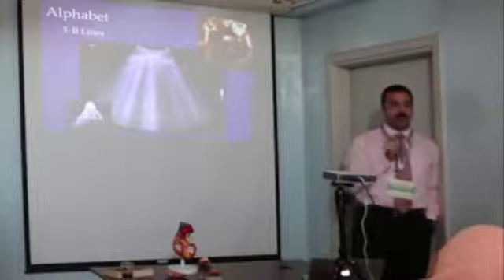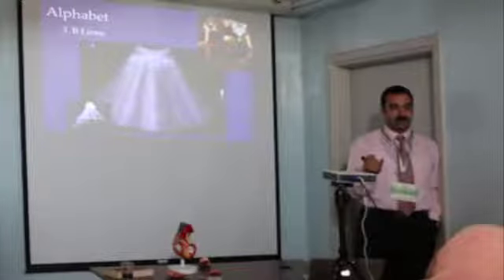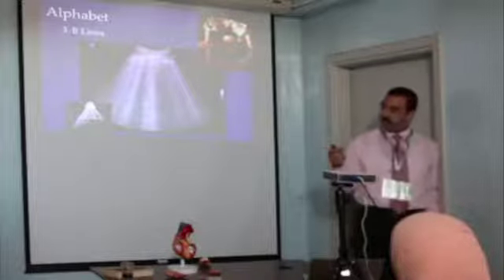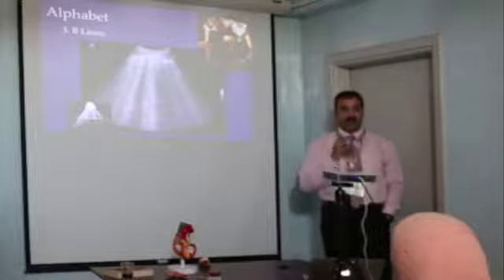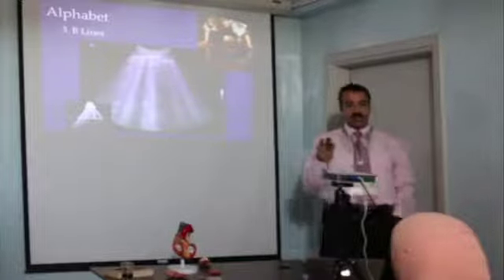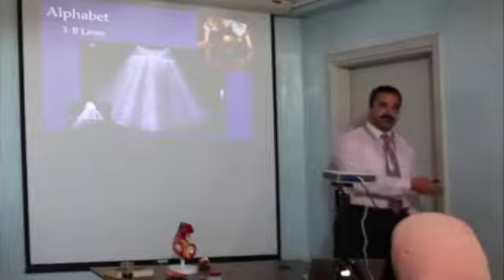What does fluid in the interstitium mean? Edema, ARDS, interstitial lung disease, whatever, pneumonia. So this is one of the challenging signs, because you need to know this basic, powerful physiology and sonoanatomy. The normal is no B lines or one or two. If it's more than this, there's a B profile.